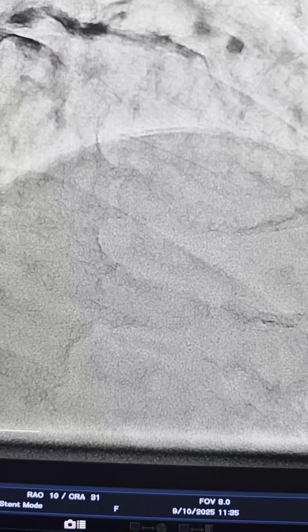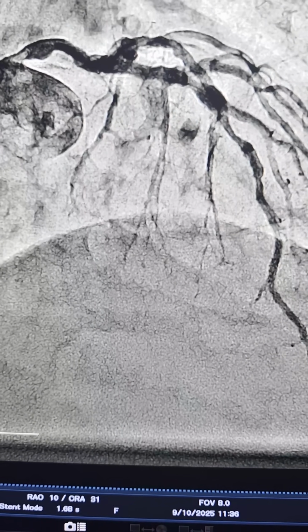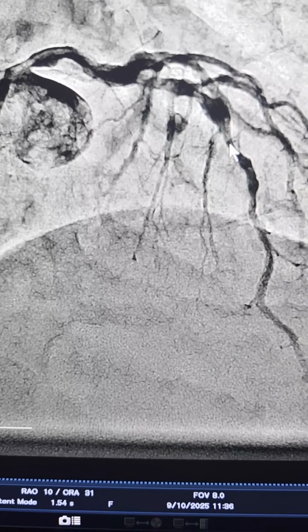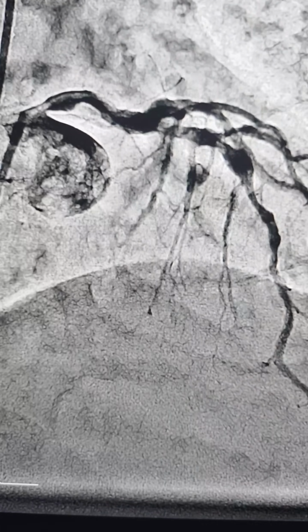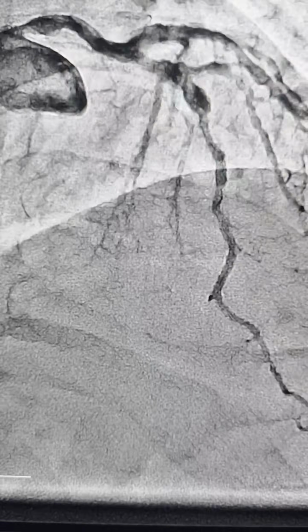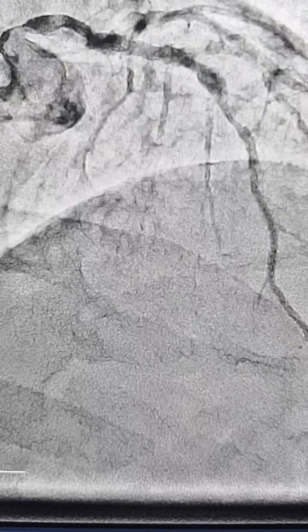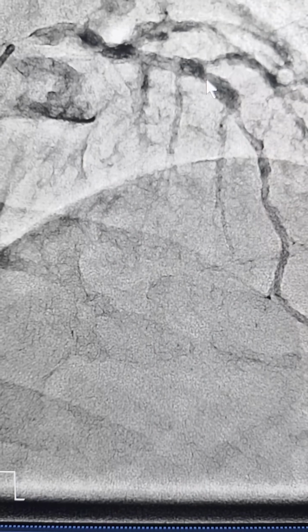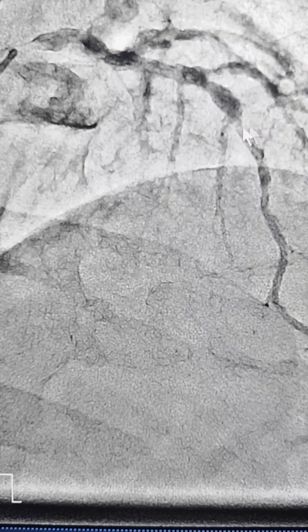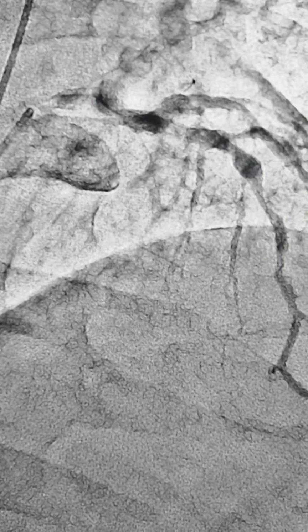So 15 minutes after this procedure, we had also taken a few views. There was a little bit of residual back here, but we didn't think that we needed to do anything. This was about 5 minutes after the original injection, and this was looked at. We changed over to diagnostic just to make sure that it's still open and everything else was fine. We did have nothing much here, but a 50% residual here. But we thought that there's no point in fixing this with a stent. Maybe this should be left alone.